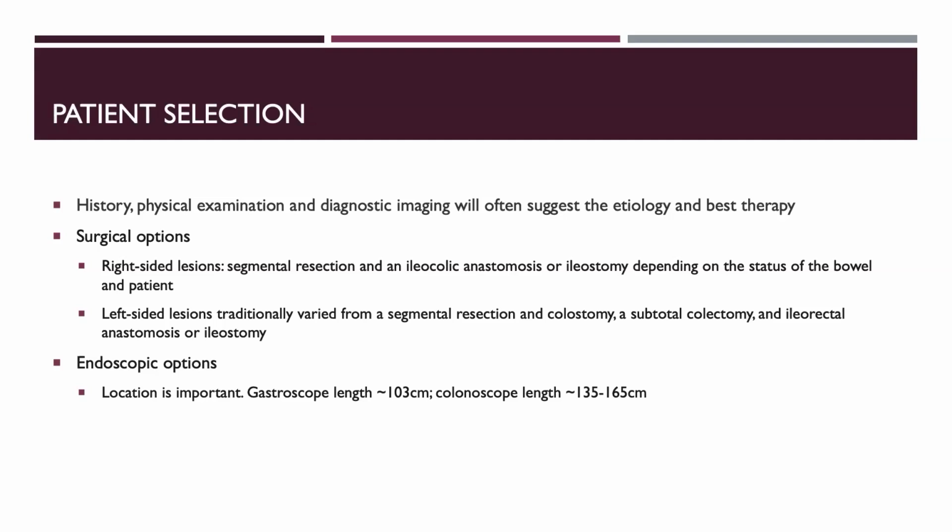And so again, there are multiple surgical options. I won't go through that, but the real question for us for the purpose of this lecture is which ones are appropriate for the endoscopic option. And in general, the rule of thumb is location is so important. So remember, a gastroscope length is around 103 centimeters.